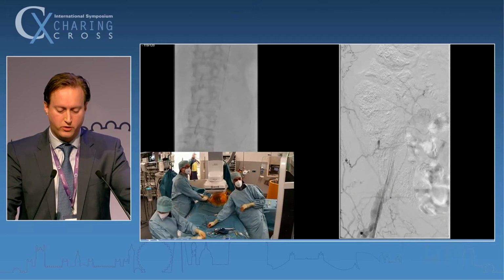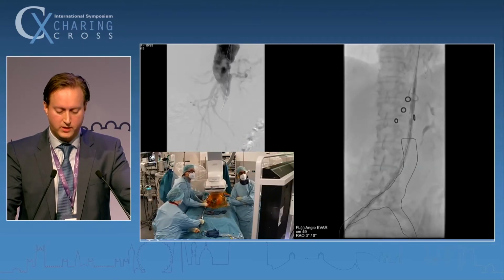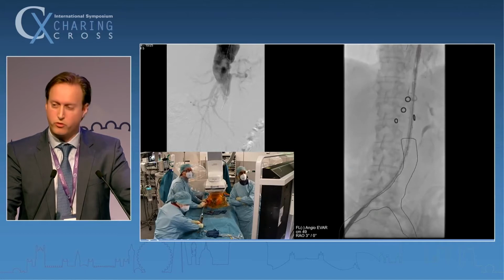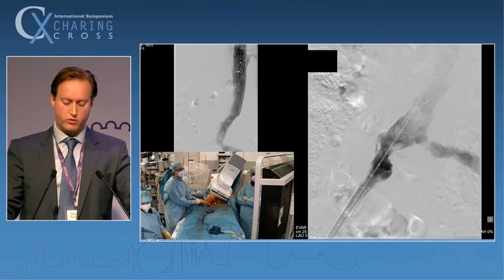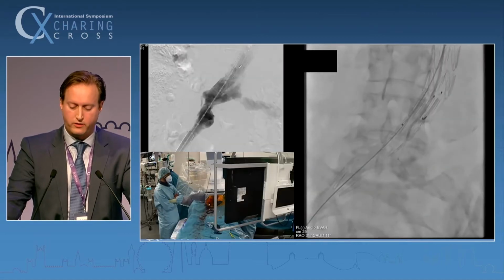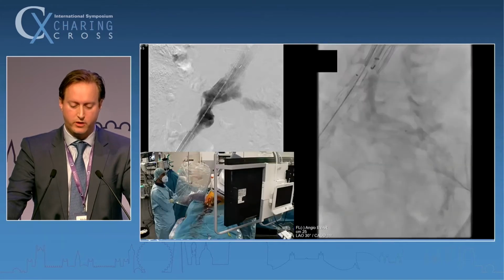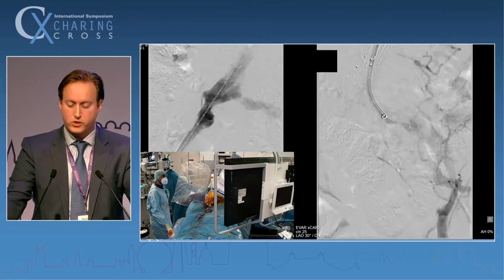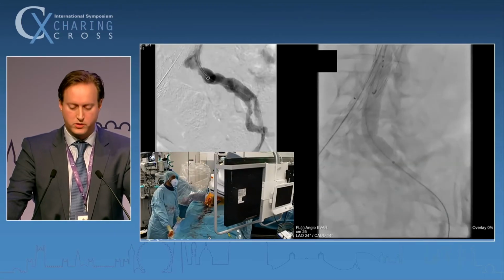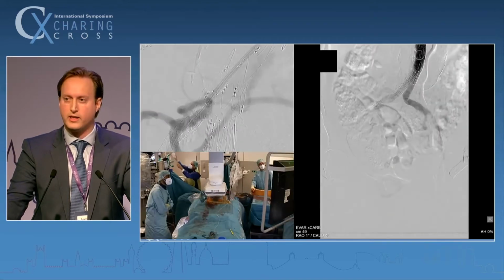This is the image after IVL treatment. And this is amazing, how we, without any problems, without any pull-through wires, can advance our endograft. This is a tight stenosis on the left, also heavily calcified, so I opted to go here from above, from an axillary approach. You can see the catheter struggling going through it. So after IVL treatment, I was able to advance my sheath without any problems, and I attached it with a balloon expandable covered stent. I treated the entire iliac axis as well.